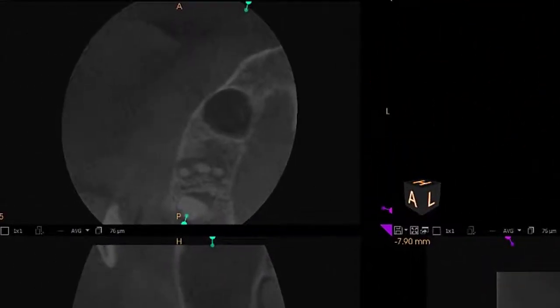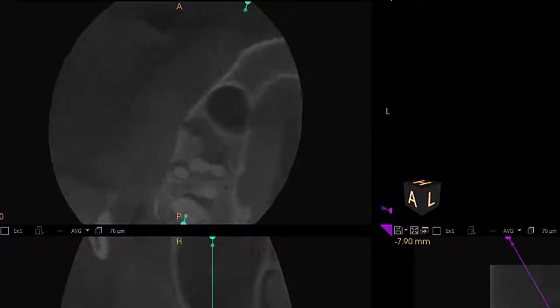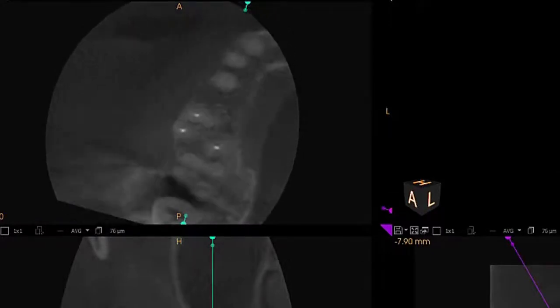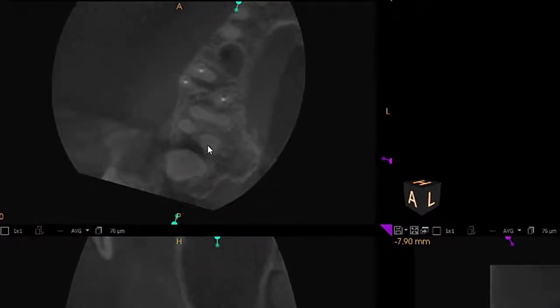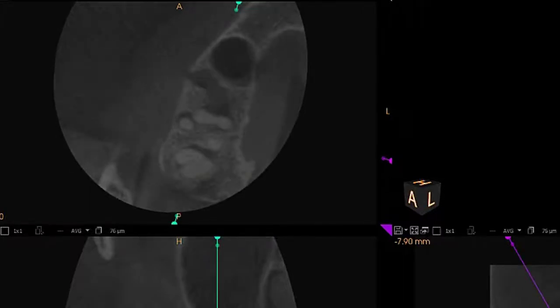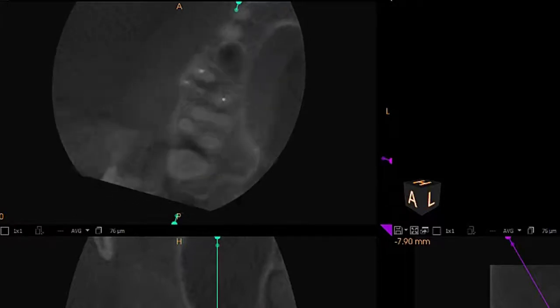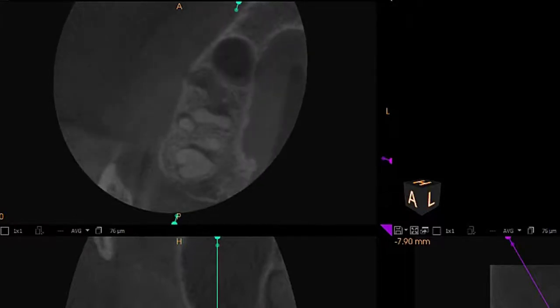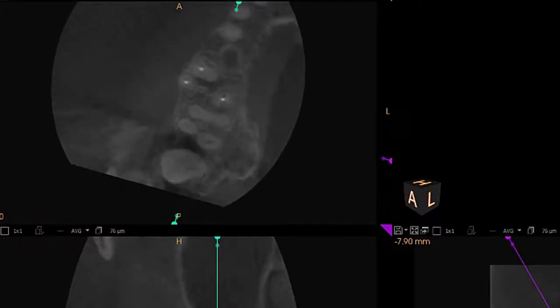As I zoom out a little bit, we can see that there's fairly significant bone loss almost circumferentially around tooth number one. Although endodontic therapy could be performed on this tooth, I think we're going to elect to extract tooth number one.